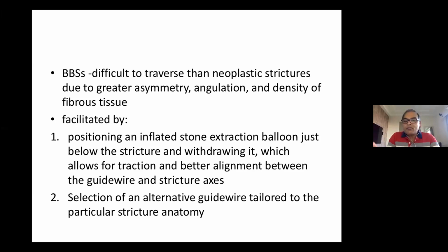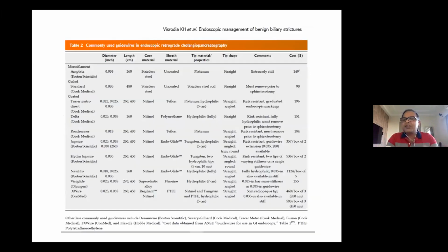and it has helped. As we know, you can shape the guide wire according to the anatomy, but still the most common workhorse for the gastroenterologist and for us also is the 0.035 wire. In some cases the 0.025 wire is also helpful. These are the wires which the endoscopists use, but factually every company has its own hydrophilic wire, yet practically everyone uses the 0.035 wire, either a J tip or a straight tip most commonly.